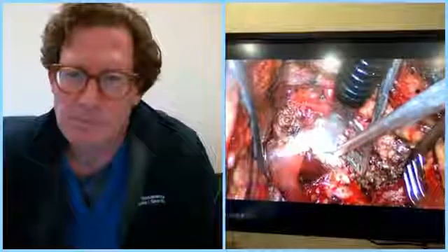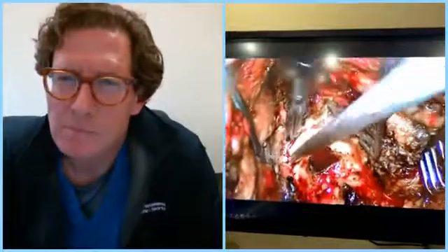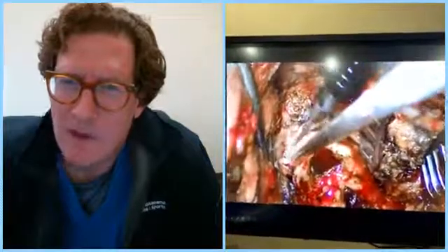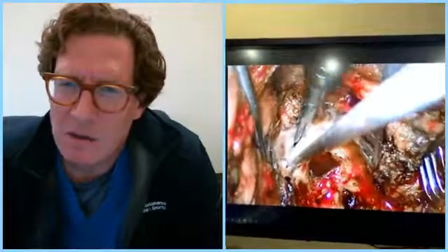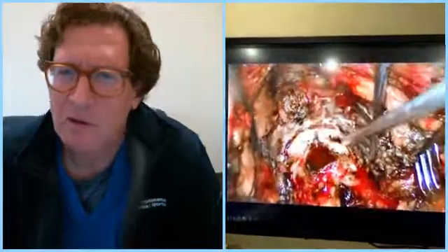So this picture shows the tool actually cutting that bone out, and the spinal cord is right below it. So we can touch the spinal cord, and you can see it just dissolves the bone. And rather than a spinning tool that will tear, and you can't do this, it's just not possible. So you have to make a much bigger hole.